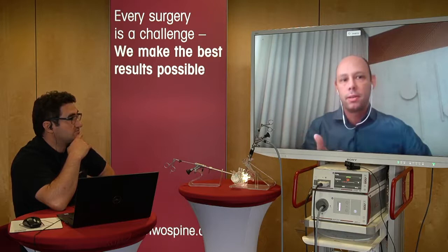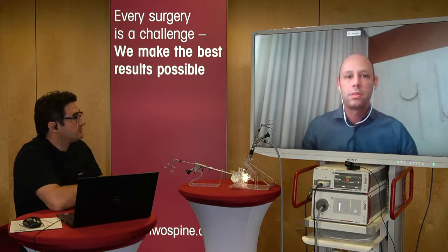We can go under the lamina and go to the other side. It's normal, it's good. We use the normal endoscope, the interlaminar endoscope, but the stenosis is good. It's very good, it's so fast. It's not good to use the working sleeve and the sleeve maneuver, because it is so big you push the roots medially, but it's good.